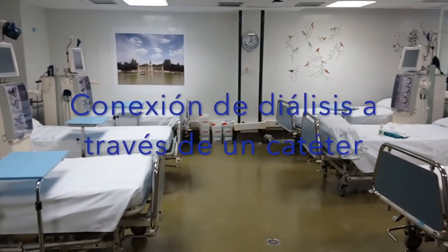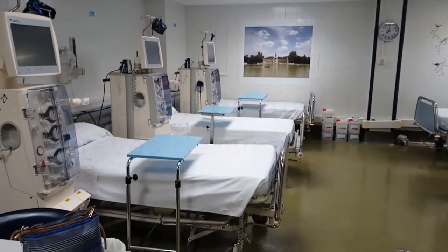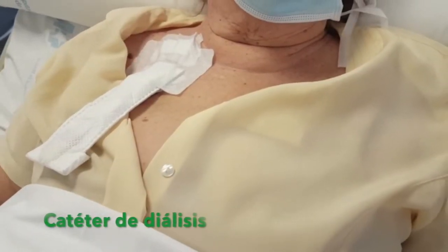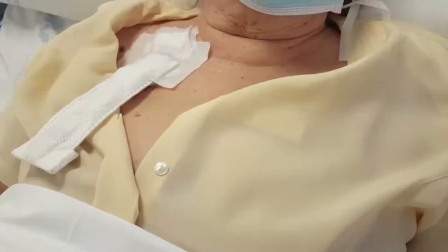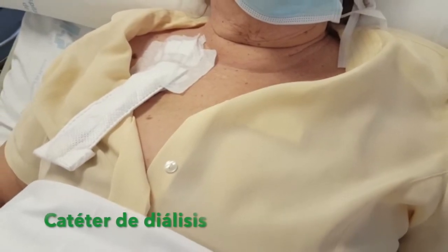This video shows a person with advanced chronic kidney disease just before starting the hemodialysis session through a tunneled catheter, which has previously been inserted through the neck. A clean, dry, white dressing completely covers the catheter.